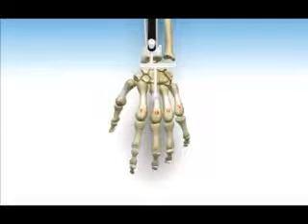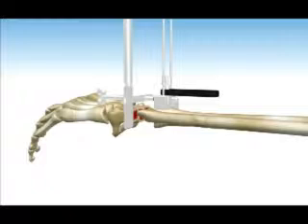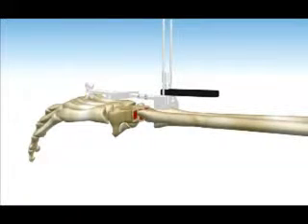Typically, the lunate, triquetrum, proximal scaphoid, and head of the capitate are resected. If the carpal cutting guide is placed correctly, the cut should be perpendicular to the long axis of the forearm. Resect the carpal bones with an oscillating saw. Remove the carpal cutting guide from the PGT guide.